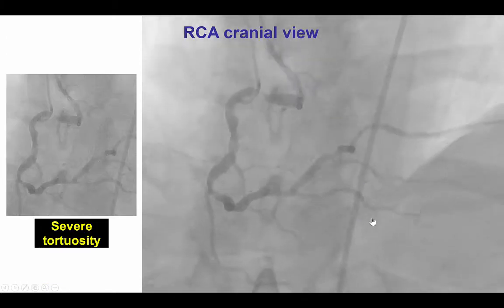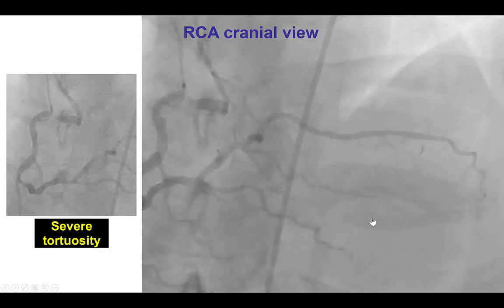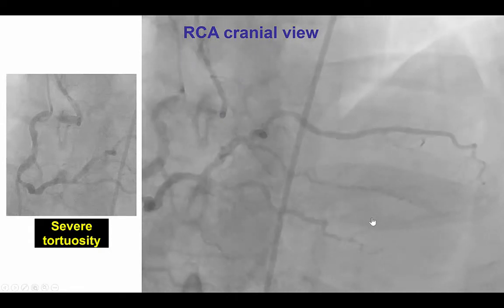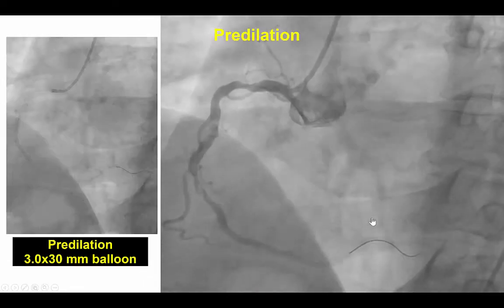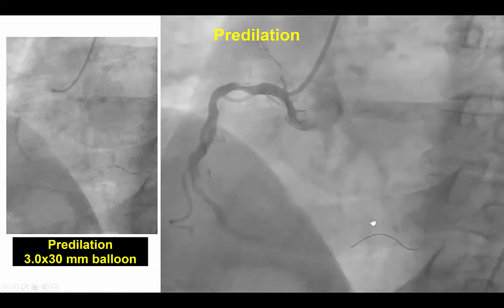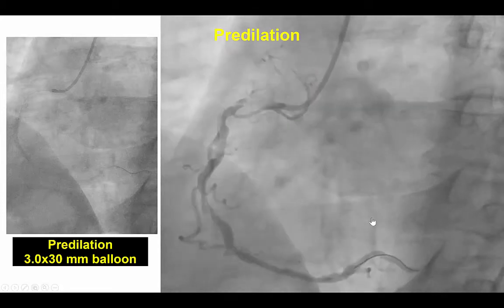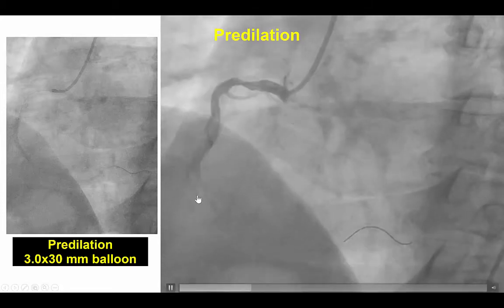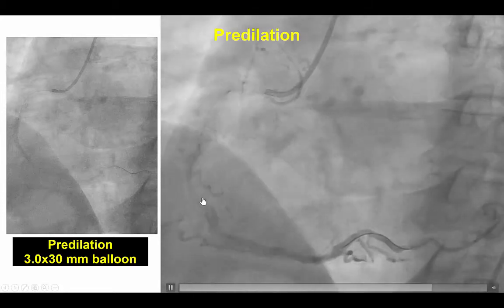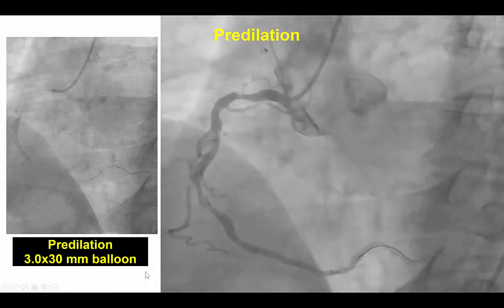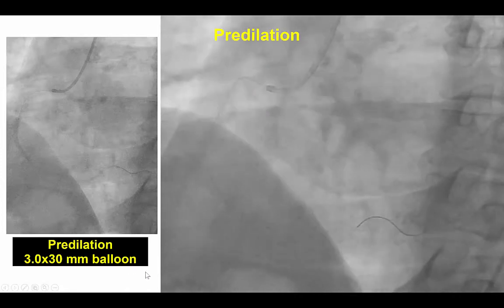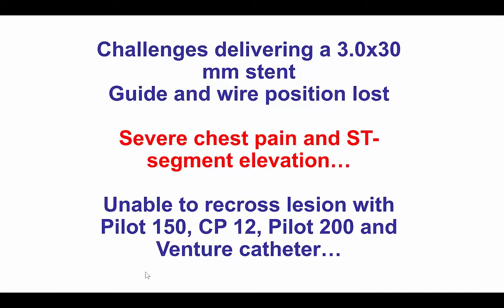We decided to proceed with percutaneous coronary intervention. The right coronary was engaged with the JR4 guide catheter and wired with a standard workhorse guide wire. During predilation there was a dissection in the mid part of the right coronary artery after a 30 mm balloon, which however had good expansion. We did have significant challenges delivering a stent, and during this process the guide was lost as was the wire position.